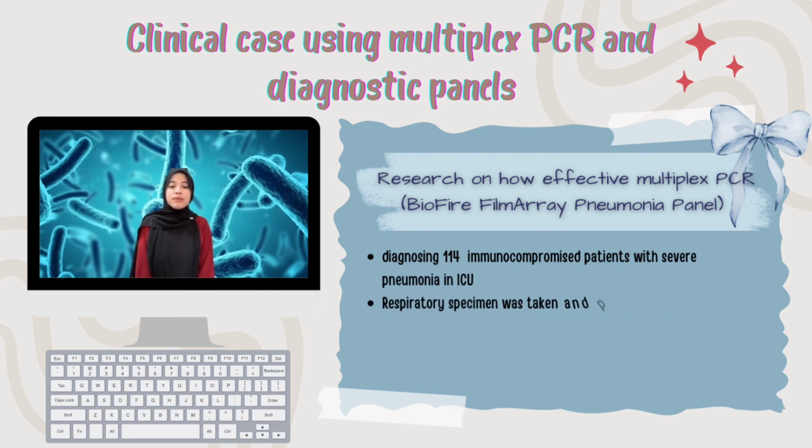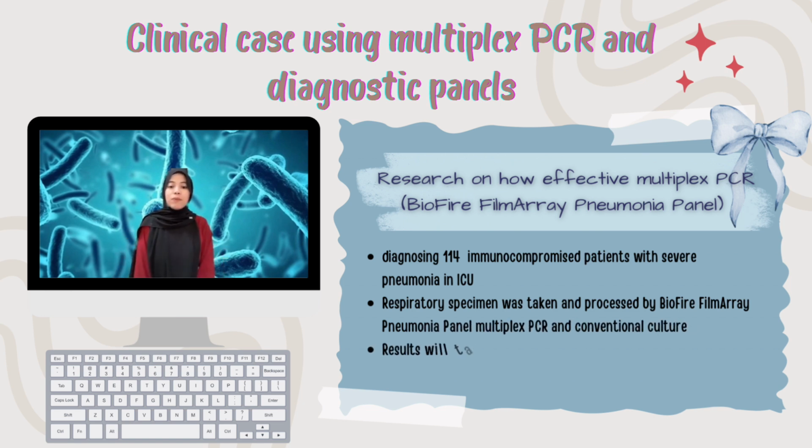The respiratory specimens were taken and processed with multiplex PCR and also conventional culture. The main comparison between these two is the time taken for the results to be obtained. Culture will take 2 to 3 days to determine the responsible pathogen, while multiplex PCR only takes 4 hours.